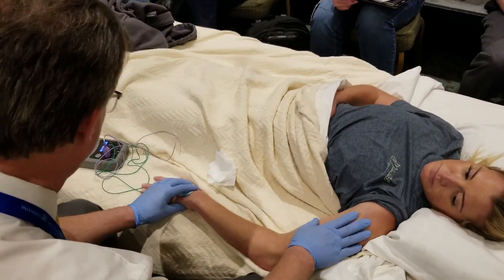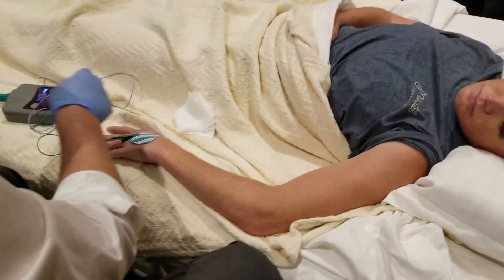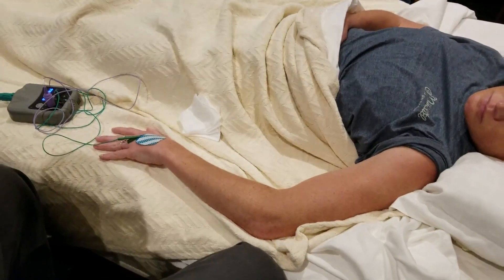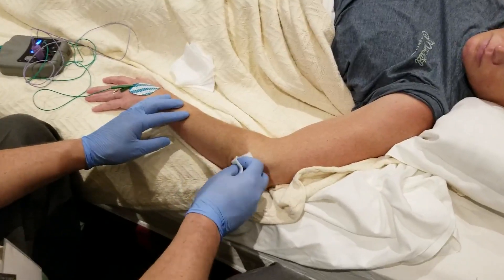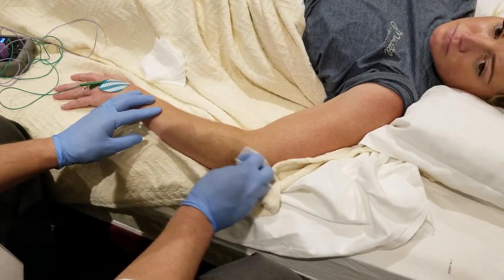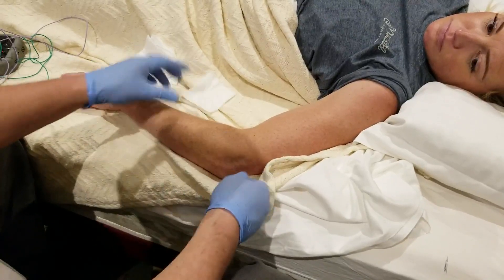Before we move on, Anconeus and Supinator. This is one that, if you're going to do a lot of EMG and you're going to look at the radial nerve, is probably one you should be able to do.